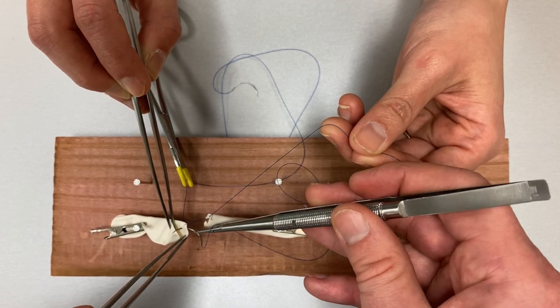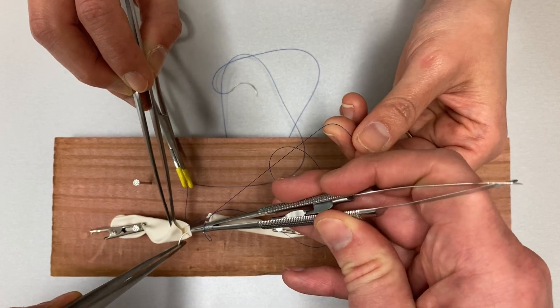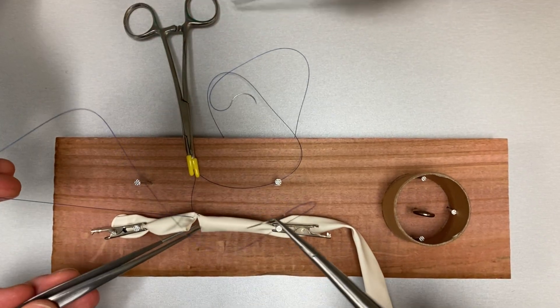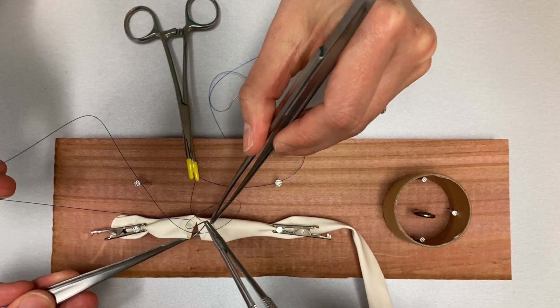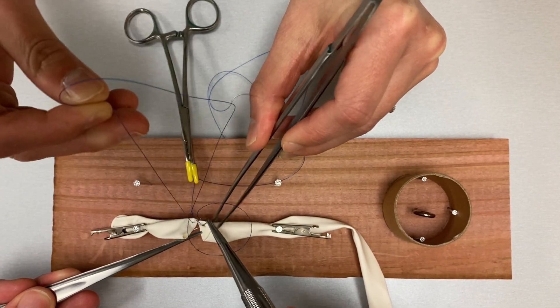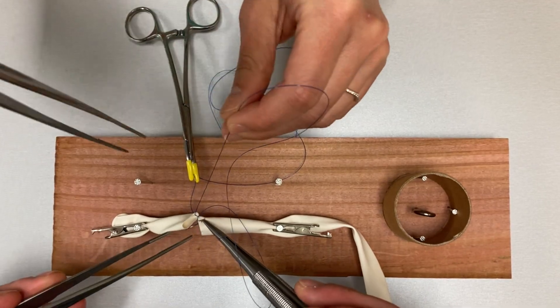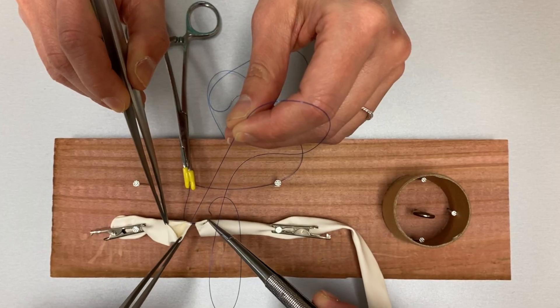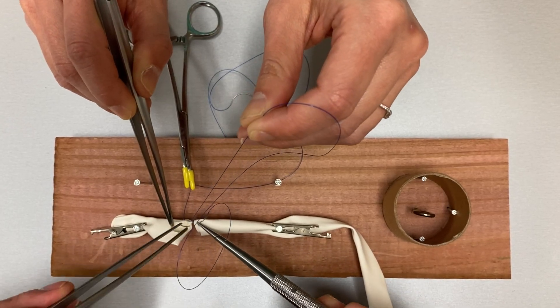Reload your suture backhand and take another outside-to-inside bite with your bite coming towards the operator. You will now begin to be able to load your needle forehand and take your bites in one. Continue running this stitch towards the 9 o'clock position of the left vessel end.